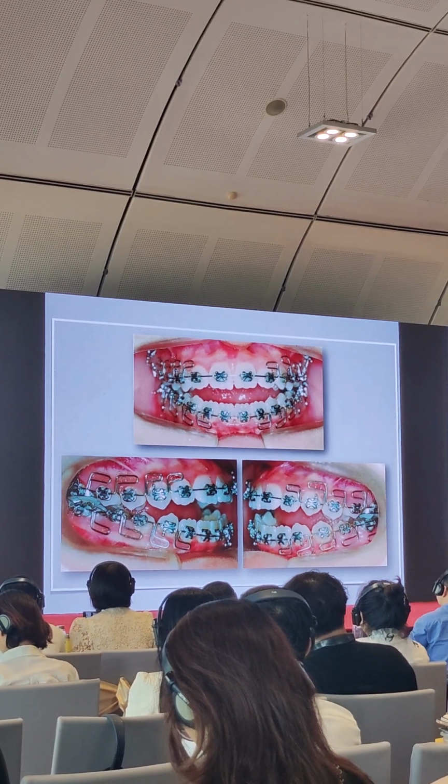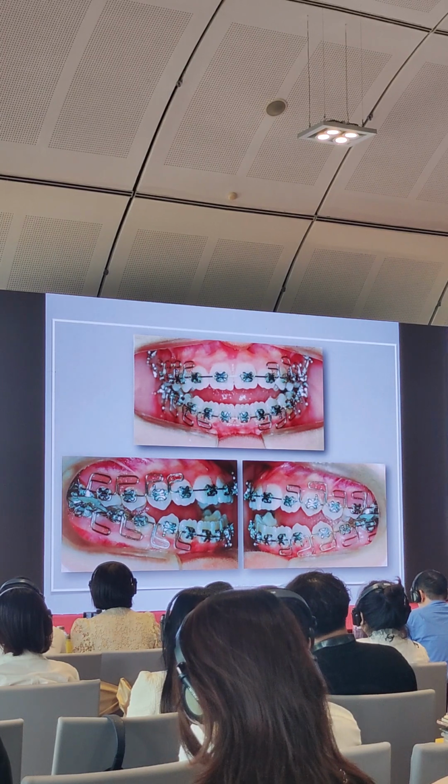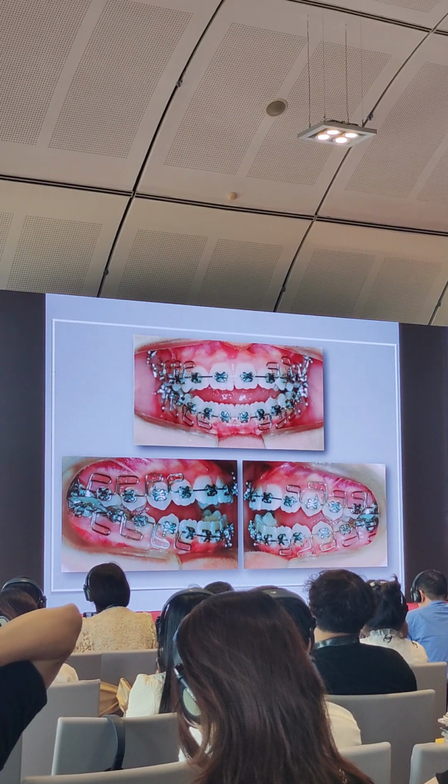If you look at the right side, you can see my molar getting into a buccal overjet, because my molar is starting to tip buccally, because of the direction of the pull on the buccal segment.